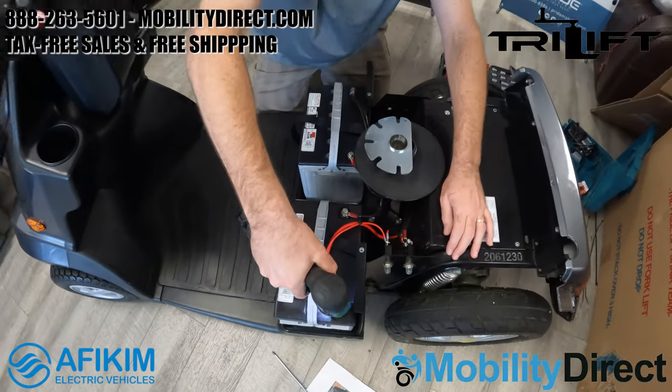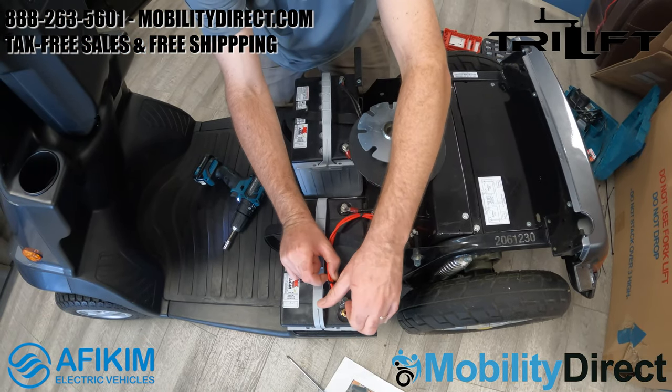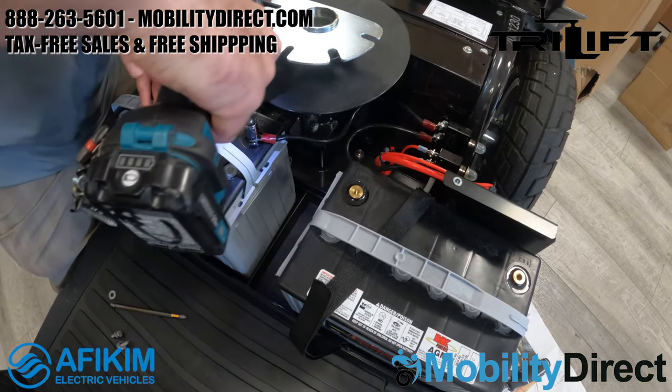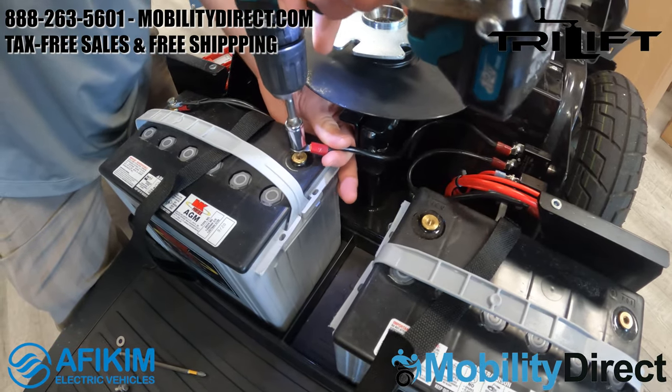From there, go ahead and disconnect the batteries. There are going to be two bolts on each battery. Just go ahead and remove those terminal connection bolts and remove the batteries. We're using a drill, but you could use a wrench or a pair of pliers to loosen up those bolts and remove them.